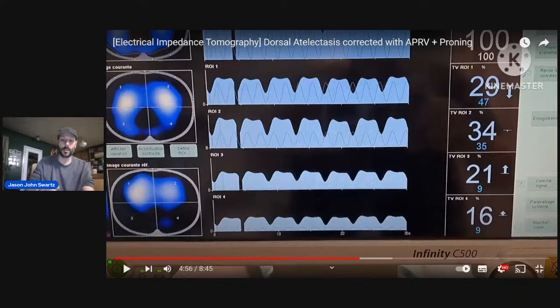That's what I said today. I said, look, she's back on the supine position, and be encouraged if she starts breathing. Then I explained, if you have a P high, in a very, very sick patient, you might be at max, like total lung capacity. But the minute they start breathing, it's very easy to just extend your T high for like 20 seconds or 30 seconds.